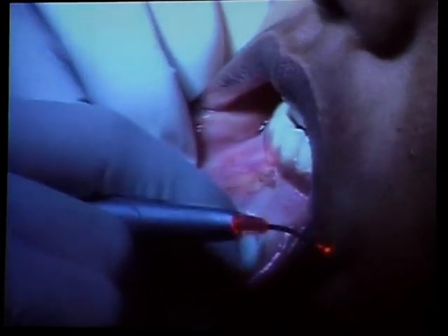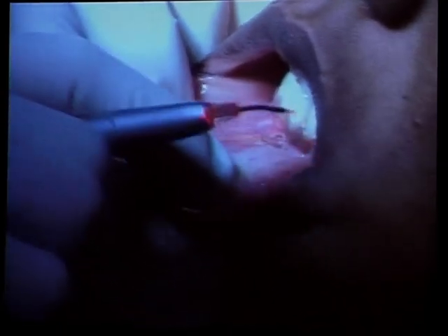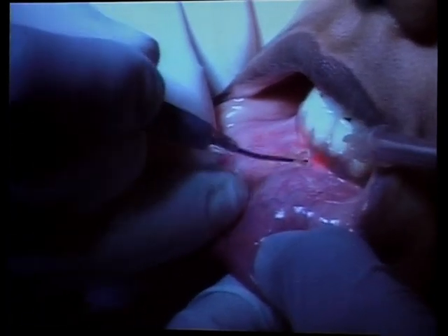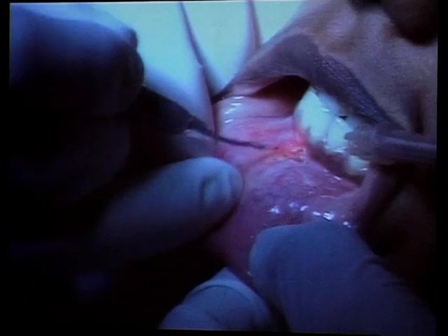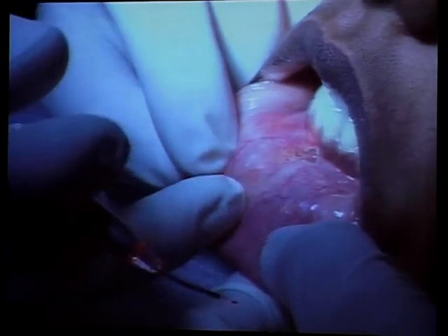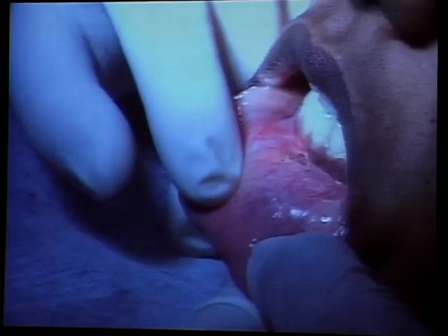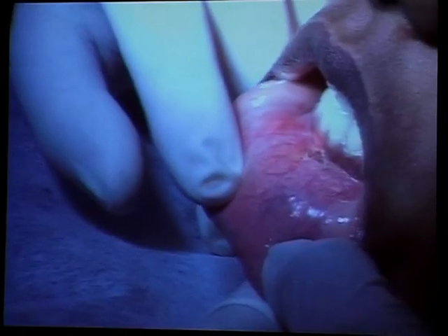So you can leave it this way, and you always get this rhomboid shape. But you can see absolutely no carbonization on the edges. Therefore you have to move the fiber all the time. Never stop to move the fiber.